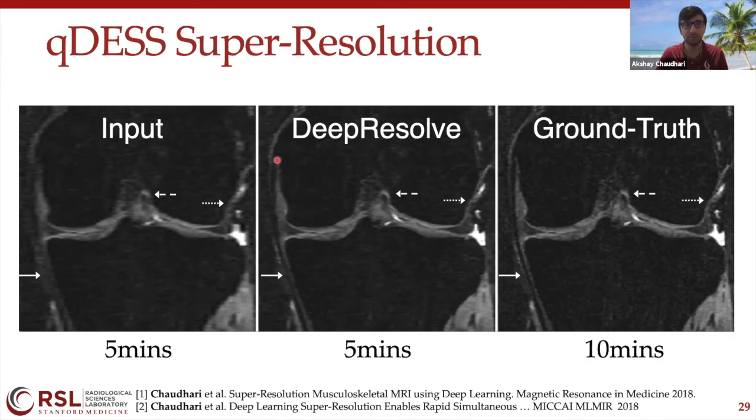So normally the bone surface should be smooth, but we see a small protrusion right here. And these osteophytes are thought to be the earliest physical manifestations of osteoarthritis activity. We had radiologists score these and grade whether or not they're able to see them in the image enhanced scans, as well as the ground truth scans. And we saw a very high concordance between those two.